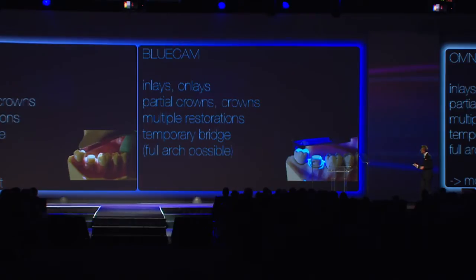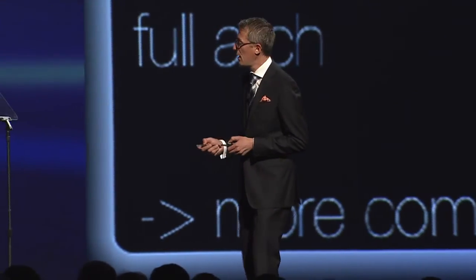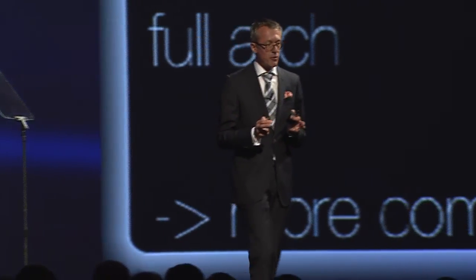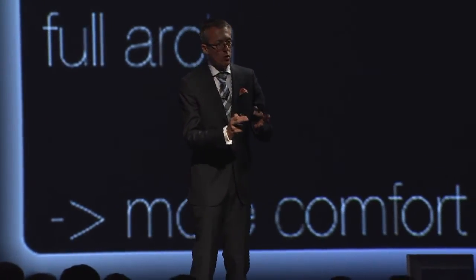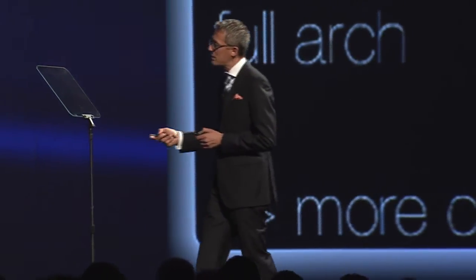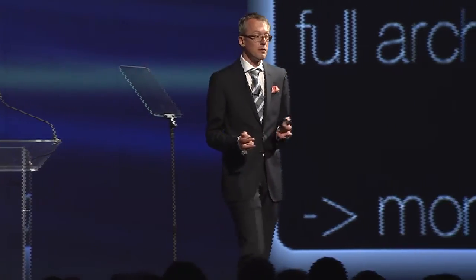Full arch is possible with the BlueCam. But you can imagine powdering a complete arch, lower jaw or upper jaw, is not that easy. We can do it with the camera. The camera is that precise. The camera can record a complete arch, and the software can calculate a 3D model. But it's much more comfortable using the OmniCam camera because no powdering is needed.